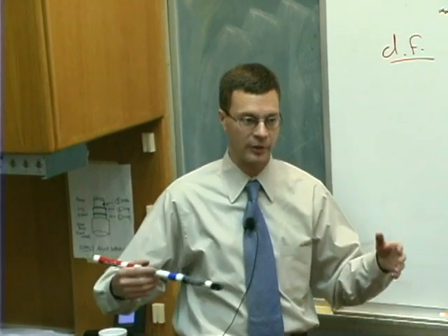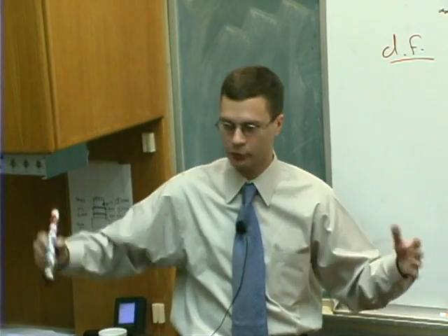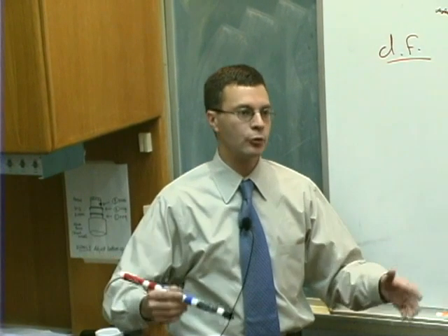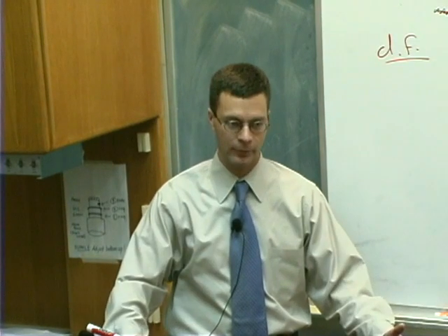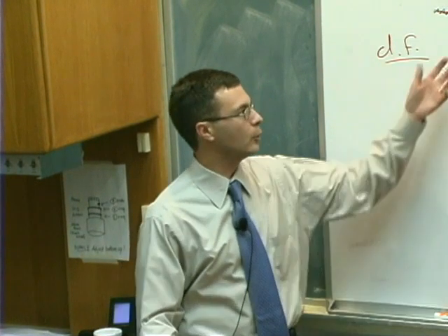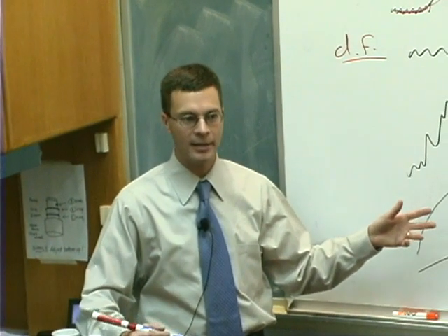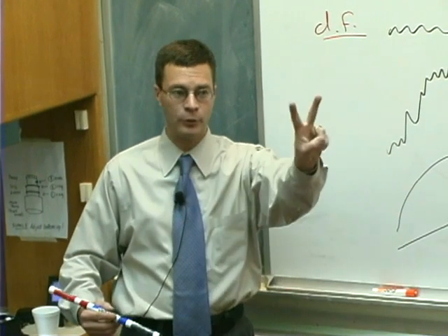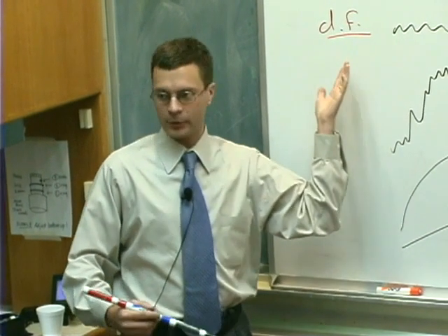And this represents the number of different ways in which your data can vary or assume different forms or shapes. Every time you try and model something in the data or take something out of the data, you spend some degrees of freedom. So if you remove some low frequencies, you have to spend degrees of freedom to do that. In fact, every frequency that you remove costs you 2 degrees of freedom. And what's the consequence of spending degrees of freedom?